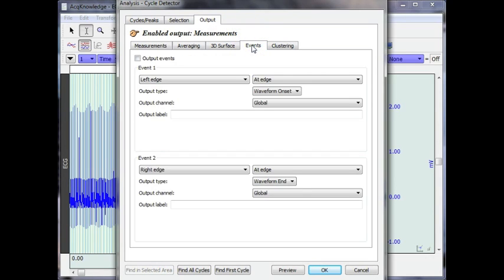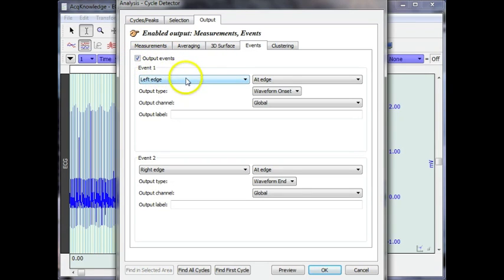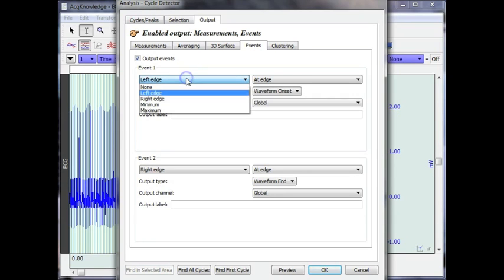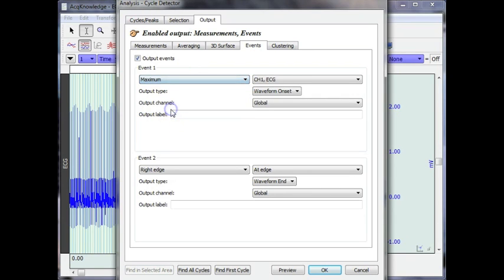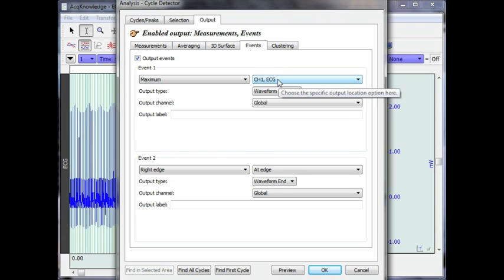Now what I'm going to do is ask the system to place a mark at the point where the measurement was taken. So we're going to output an event and event one is going to happen at the maximum point, the peak, for channel one ECG.